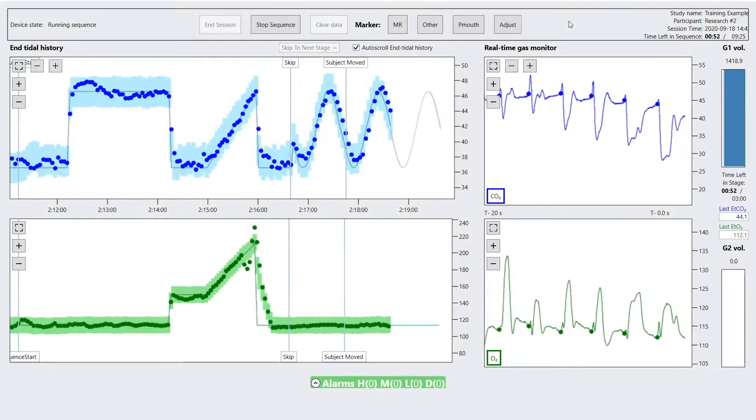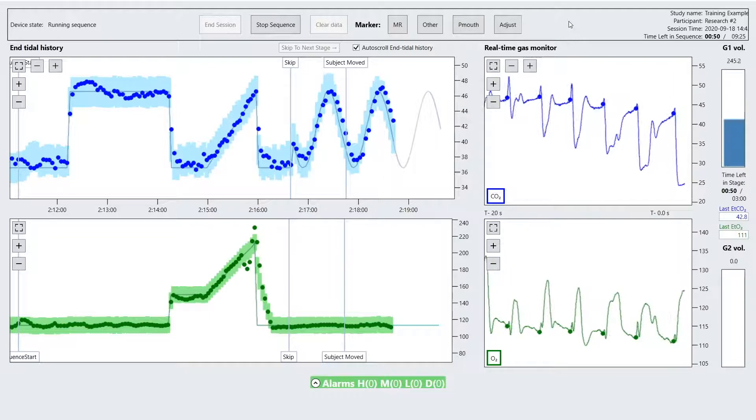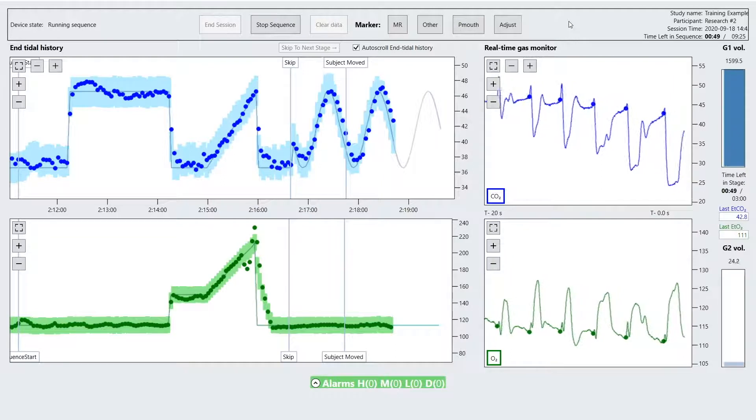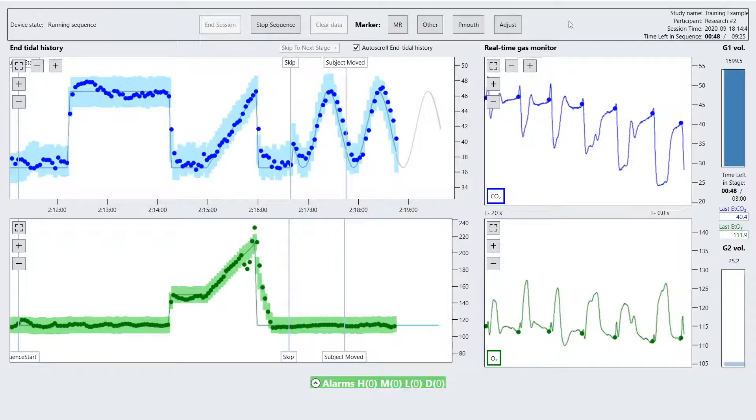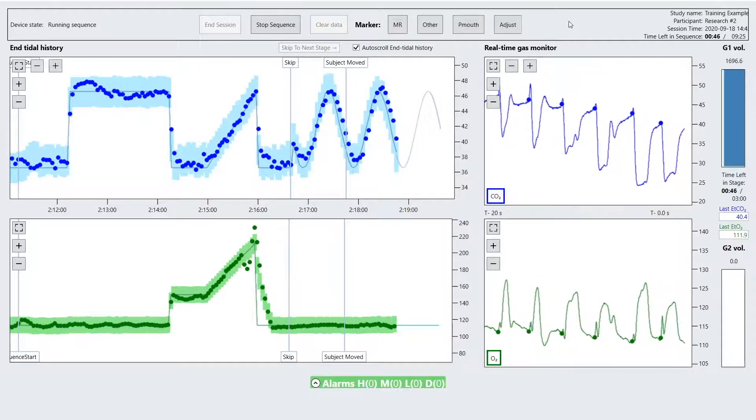Toward the bottom of the screen is an alarm indicator. A green bar indicates that there are no alarms currently during operation.